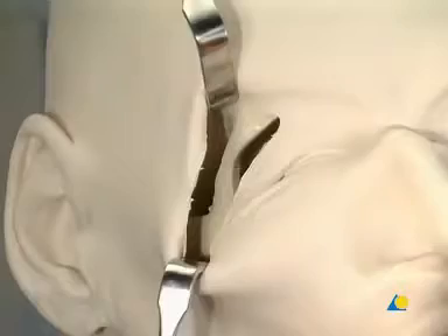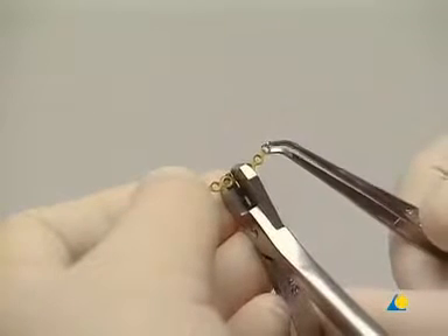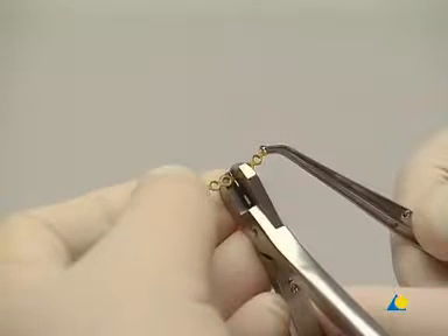The reduction must also be checked at the zygomatic frontal suture and the lateral orbital wall. It's important to confirm that there's no step off between the greater wing of the sphenoid and the zygoma. A 1.3 curved orbital plate is selected to stabilize the fracture in this area.